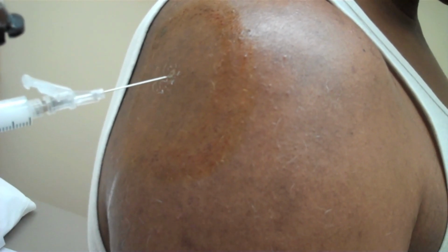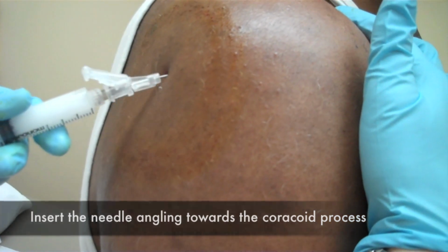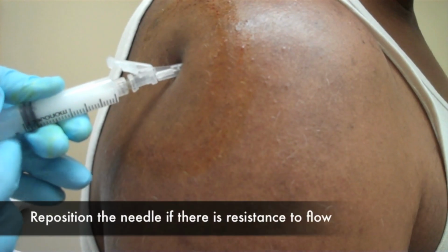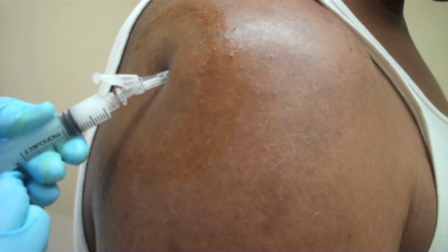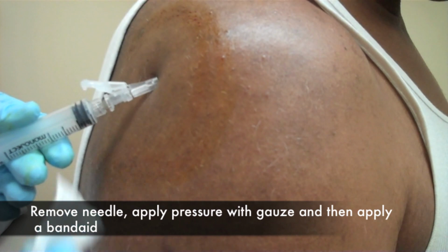Here is another example of a posterior approach to the subacromial bursa injection. When the patient has more soft tissue mass, the landmarks are not as visible and you must really palpate the bony landmarks. If you encounter resistance to flow, reposition the needle. Resistance may indicate that you're in a rotator cuff tendon. Injecting a tendon may cause rupture of that tendon.